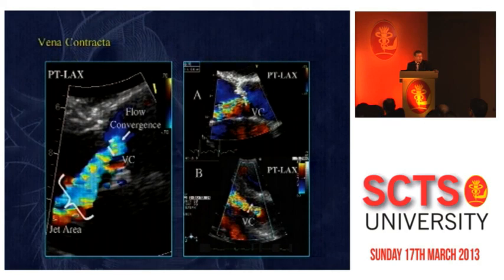And we've compared in an analysis some years ago, recommended by the guidelines, the apical approach to the parasternal view like I've just shown from this TEE examination. And you see that there is a lot of noise in the CW Doppler signal when you assess that from the apex, essentially because the jet is going almost perpendicular to the ultrasound beam, so it cannot be really assessed. And from the left parasternal view, you see that the jet is going down in exactly the same direction as the ultrasound beam, so it is ideally placed to make the measurements.